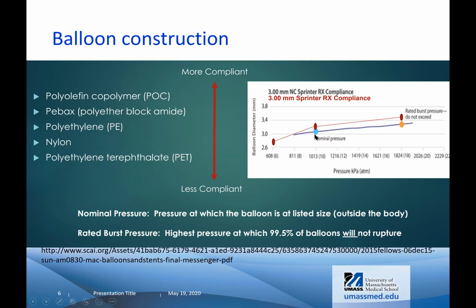And then once we achieve some size with a stent, the post-dilation is usually done with an NC balloon. You don't want the balloon used after this to get too large in size. So that's why we use the NC balloon. The other good thing is it stays at the same size and uniformly.